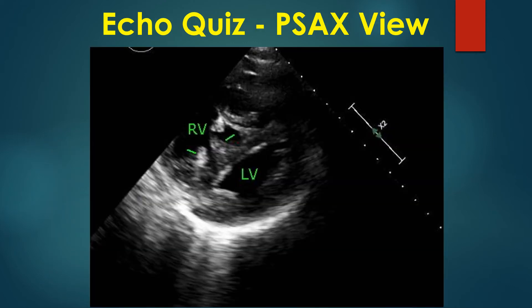In the echo image shown, right ventricular trabeculae can be seen as grossly hypertrophied as part of severe right ventricular hypertrophy, pointed by green markers.